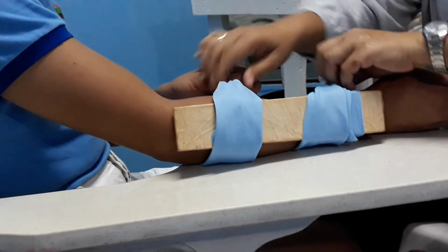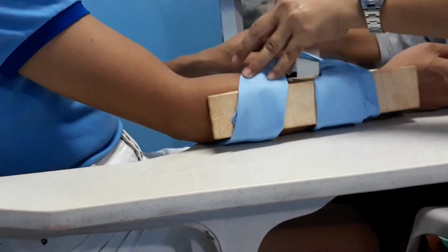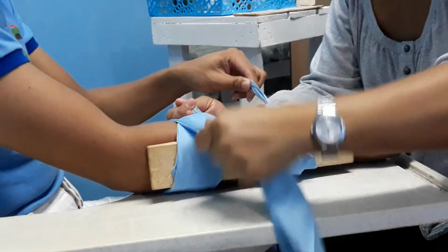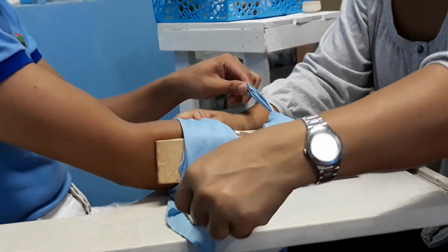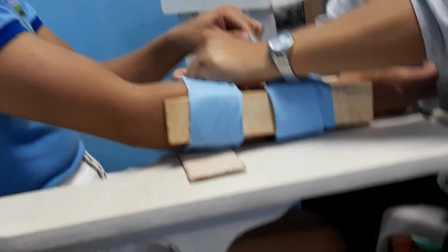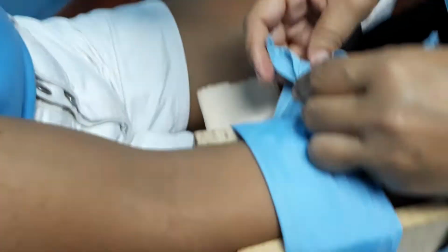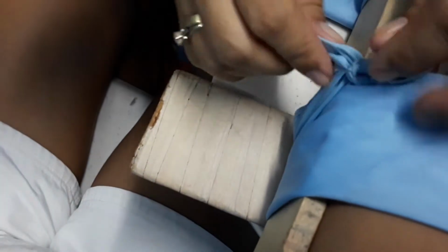Like that. Okay. So first, you have to anchor. You hold this, please. First, you have to tie the bandage near your client's body. Okay, like that. Insert, and then apply your square knot. You know already how to apply the square knot. It should be one over the other, and always over the other. Okay, like that.